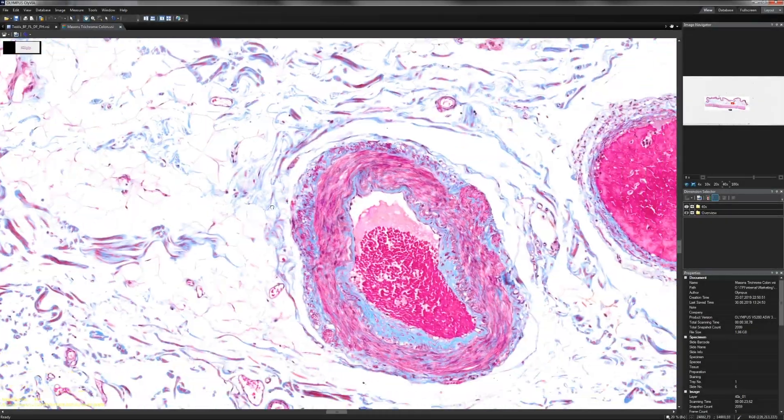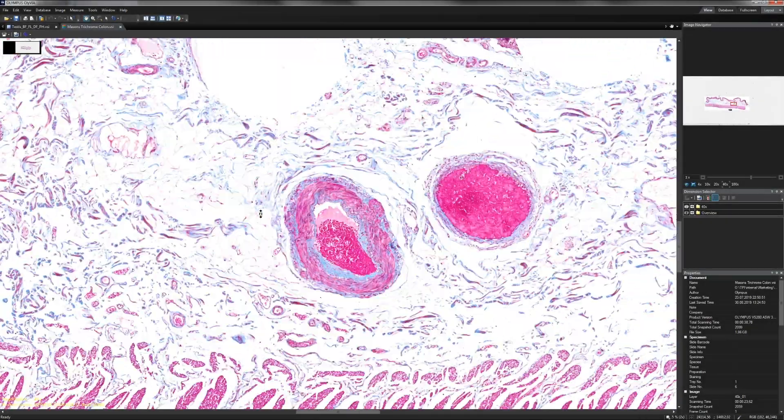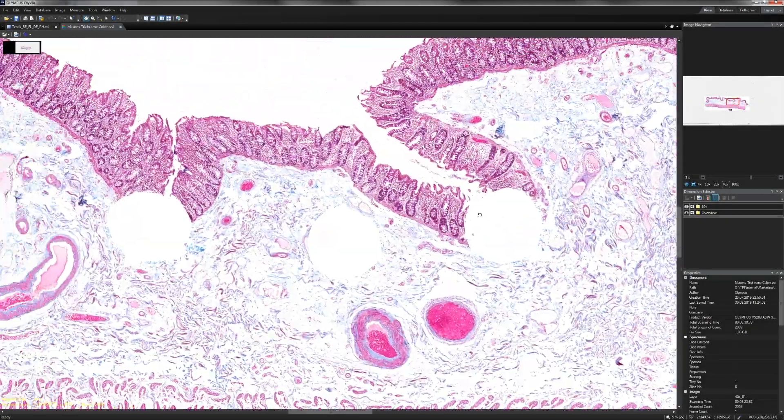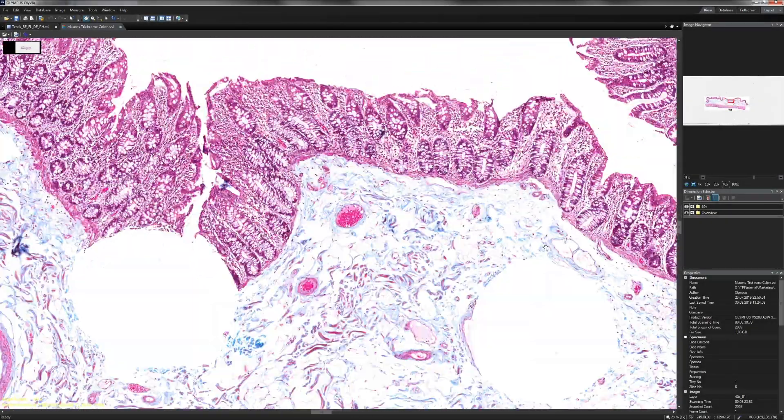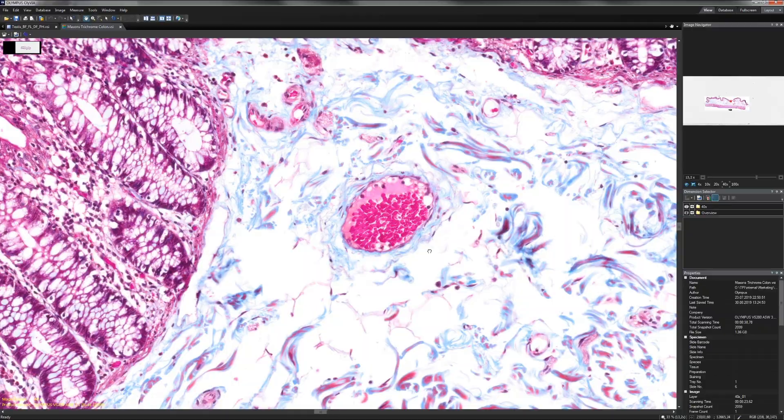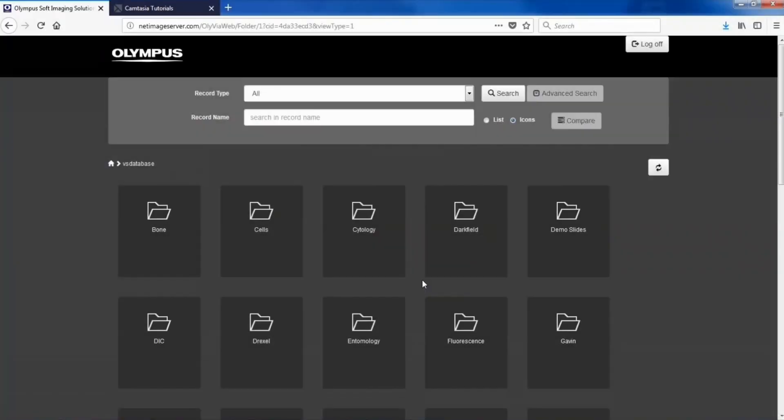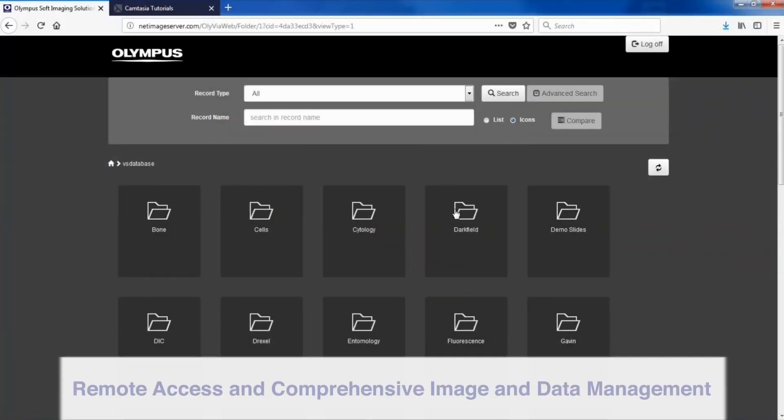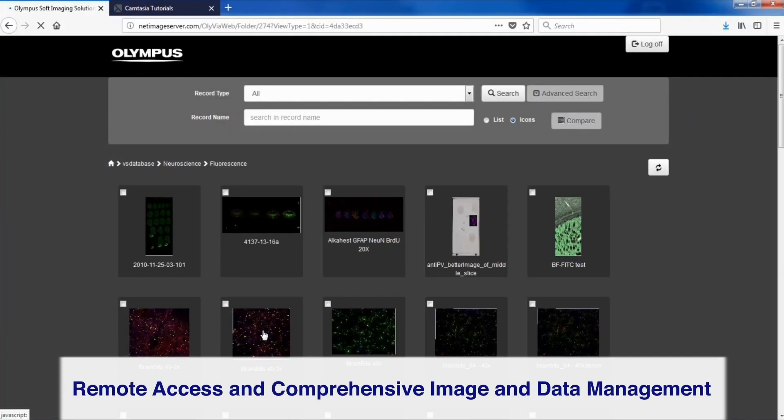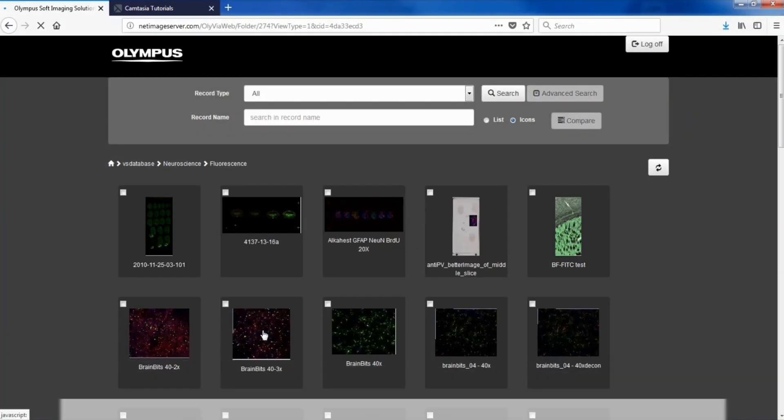Olympus' OLIVIA viewer software can access virtual slide images on local or network storage, and images that have been saved on the NetImage Server database.